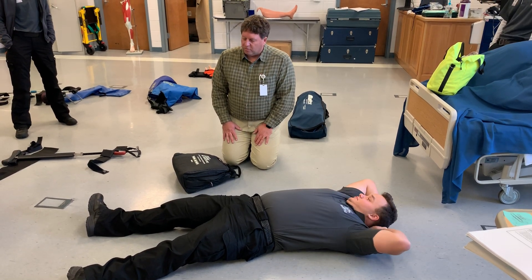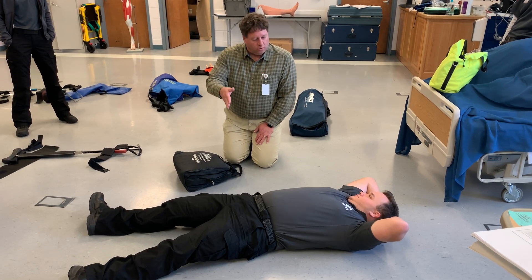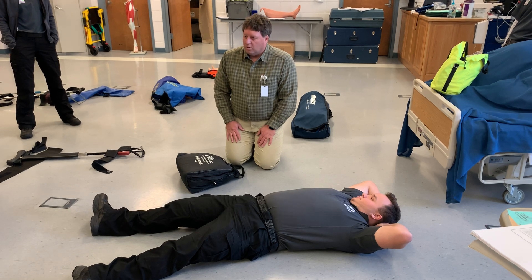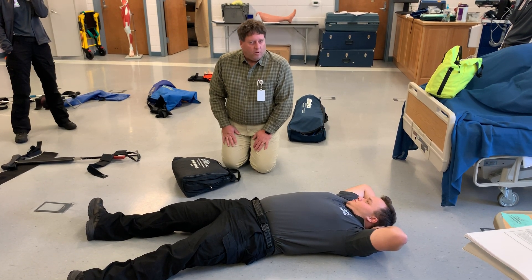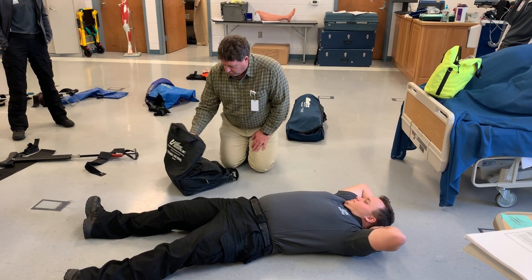There still is a purpose for these as an air splint, especially if a patient has two femur fractures, so we can still use them for that. But since they're so out of favor and we didn't use them regularly, it was taking too long to apply them, and they've basically been taken off almost all ambulances. So don't expect to find these devices, but just so you're familiar with them.